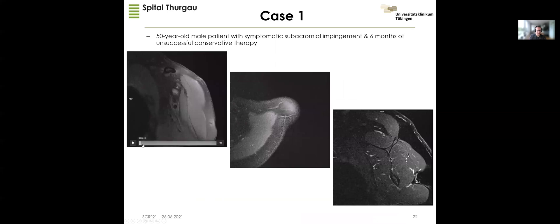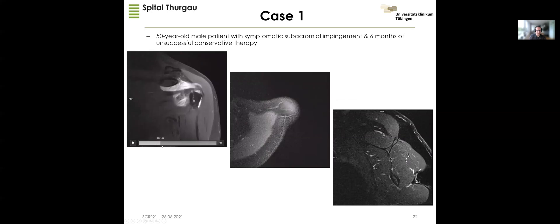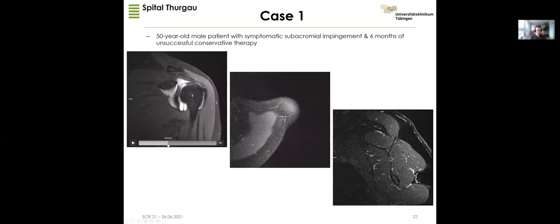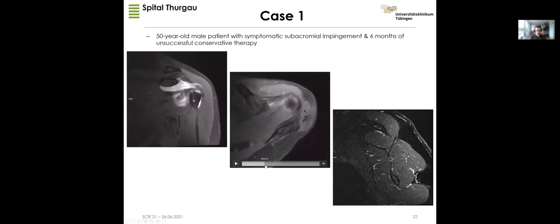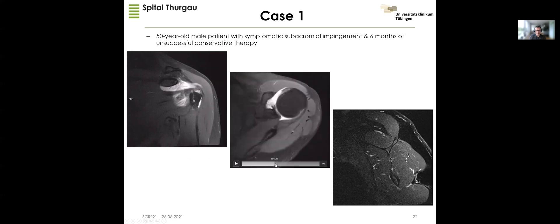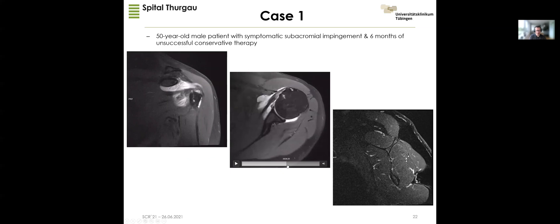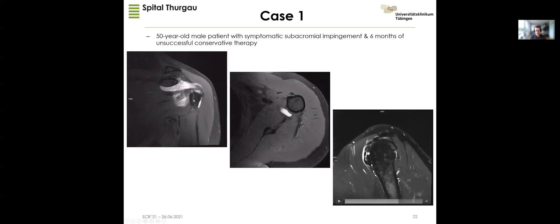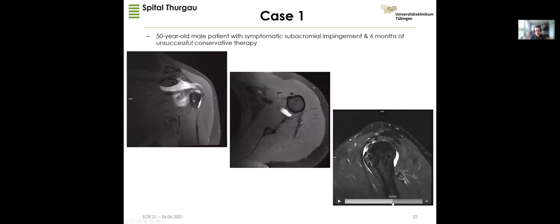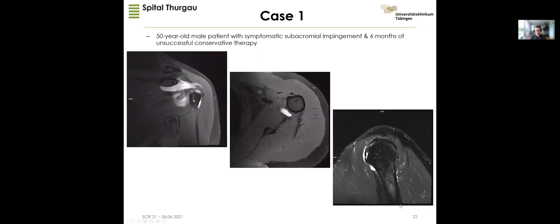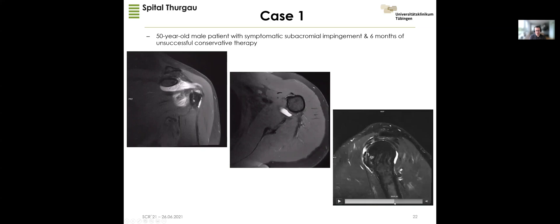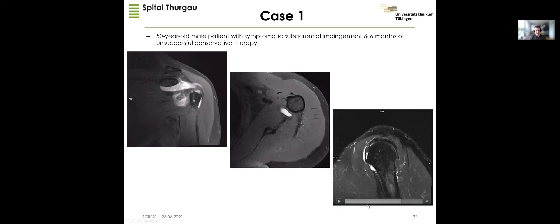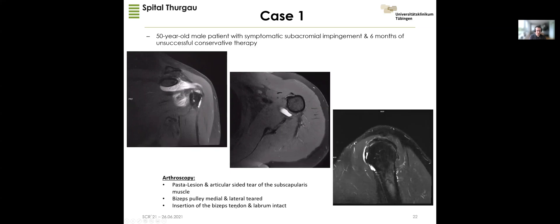Case one: a patient with conservative treatment of subacromial impingement. On the coronal view the LHBT attachment looks quite normal, there are signal alterations of the subscapularis tendon, and we cannot detect pulley system pathology here. On the axial view we cannot see the SGHL, there is no subluxation, and the distance is not increased. But on the sagittal view we see a superior articular-sided subscapularis lesion and an anterior articular-sided supraspinatus lesion — both highly associated with pulley injuries — and we also have a displacement sign with direct contact between the biceps tendon and the superior part of the subscapularis fibers. This was confirmed as a pulley injury with complete tearing of the medial and lateral parts of the pulley.